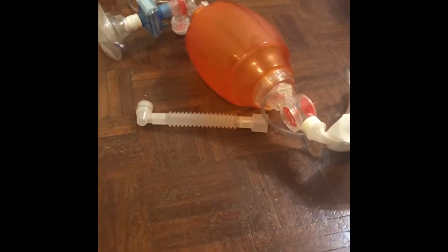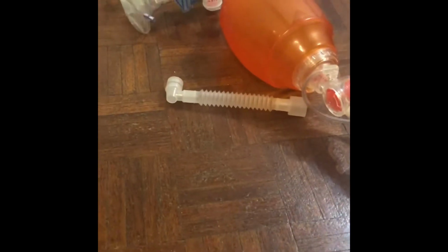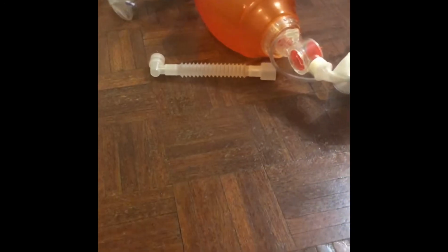Now we'll go through the intubation equipment. So we're going to make sure we've got a BVM connected to oxygen. We're going to make sure that we have a mount for when we get rid of the mask and connect it to the tube. We're going to make sure we've got ET tube, 1 of each size.